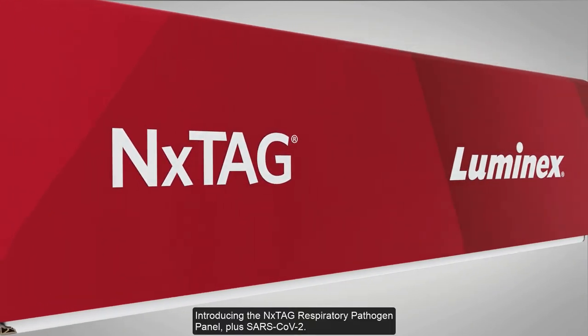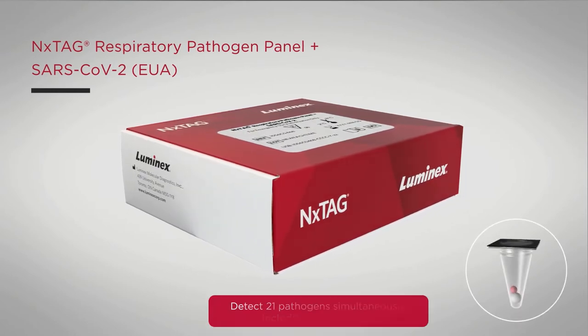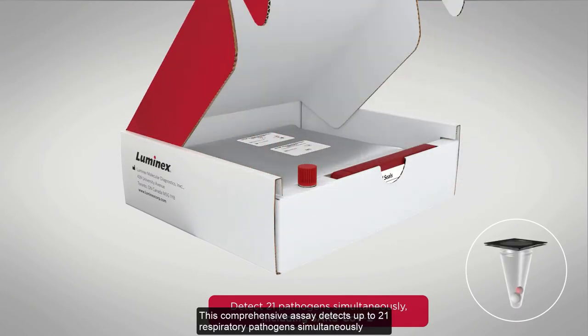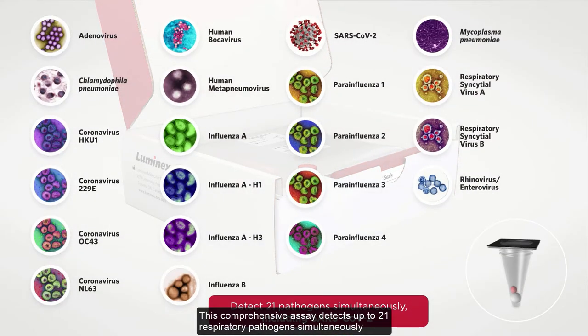Introducing the Nextag Respiratory Pathogen Panel plus SARS-CoV-2. This comprehensive assay detects up to 21 respiratory pathogens simultaneously, including SARS-CoV-2, in a closed-tube, easy-to-use system.